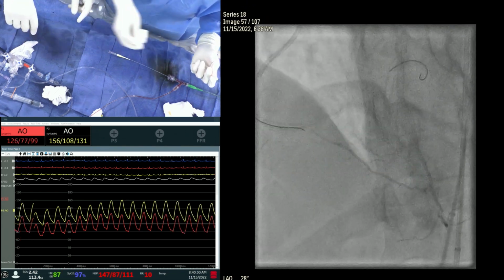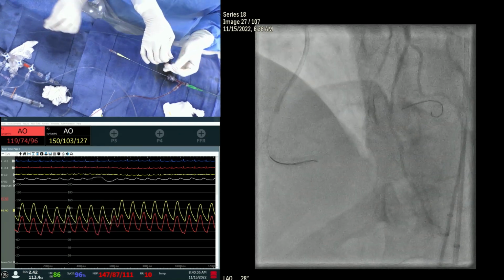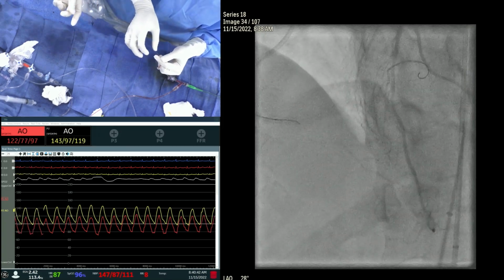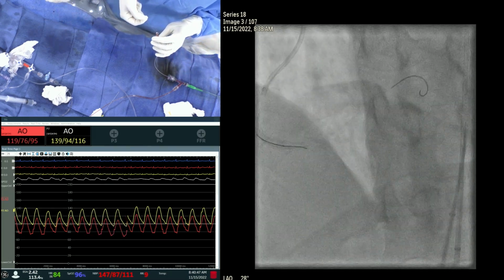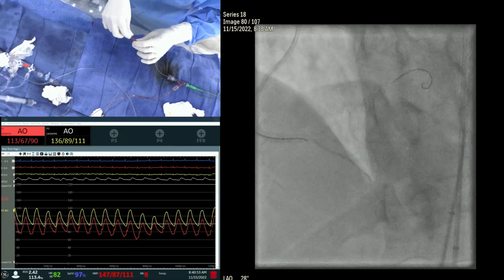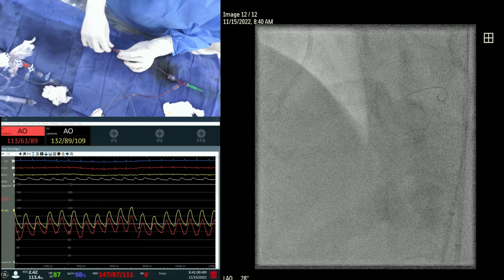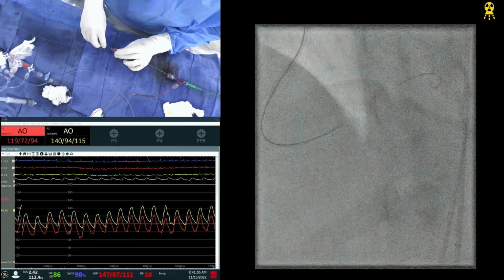Ready? We take this out. Keep this one, Runthrough. See that angle? The tight disease distally, and then the angle of the PDA. Definitely unfavorable morphology. So I've placed the Fine Cross distal to the PDA.